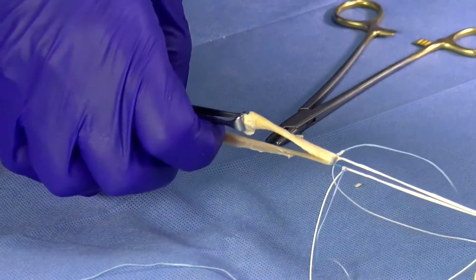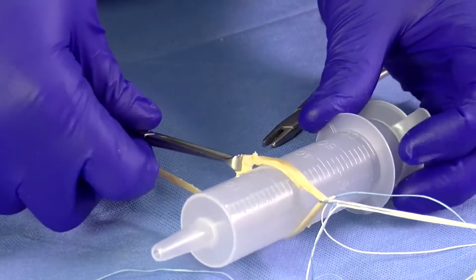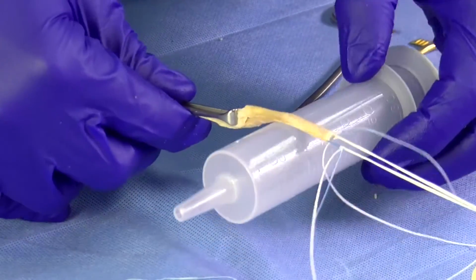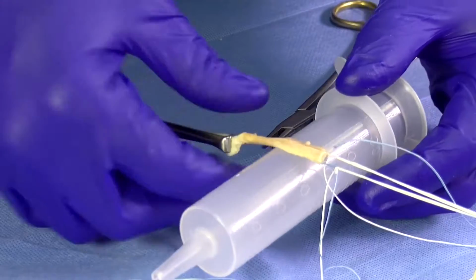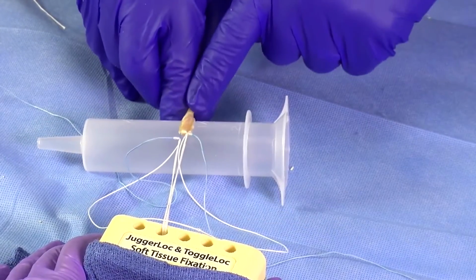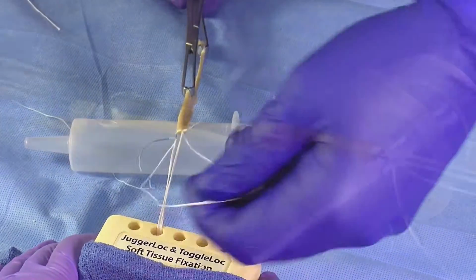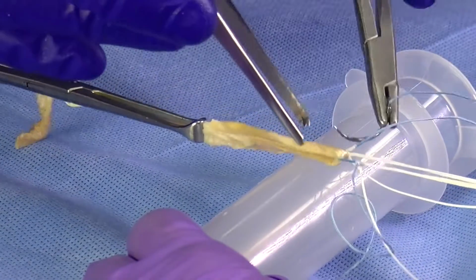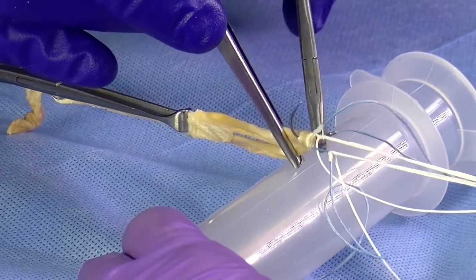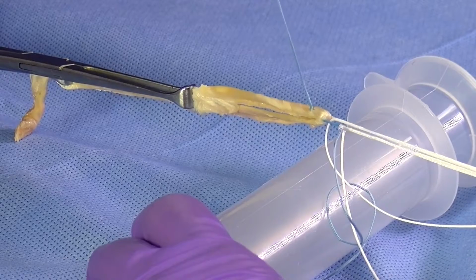Now, because this is coming out, what we have often done in the shoulder is we'll take a 20cc syringe. It tends to work well to get in there between the implants so that it can sew down on itself. I'll even take an 18 gauge needle and pass it through and insert it into the syringe so it holds the whole thing together and lays it out for you. We have the tendon doubled over through the implant. We've determined our length, and then the process is very similar.